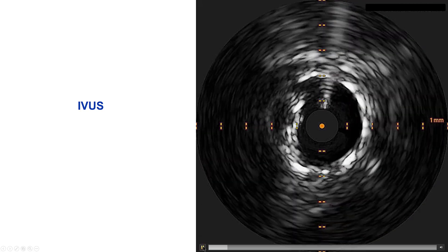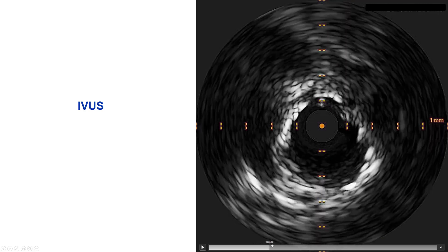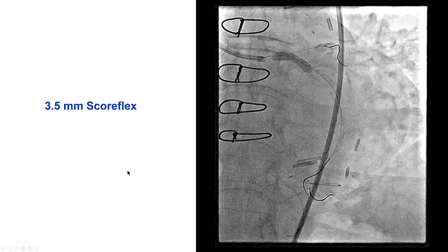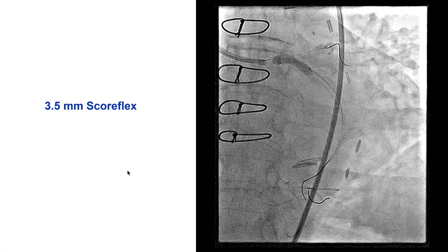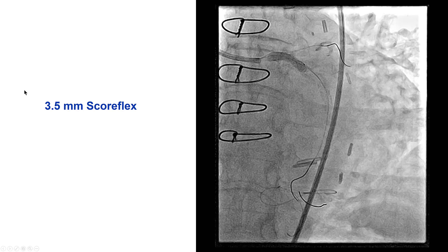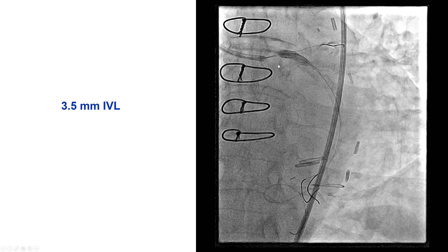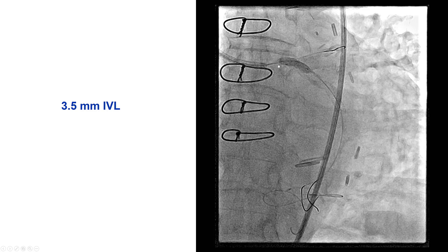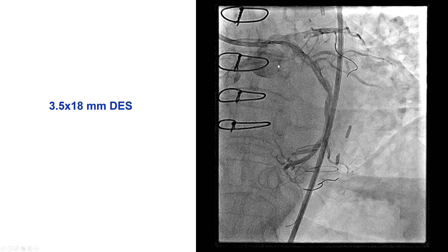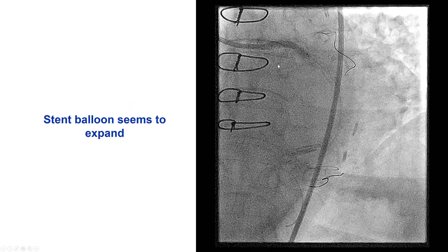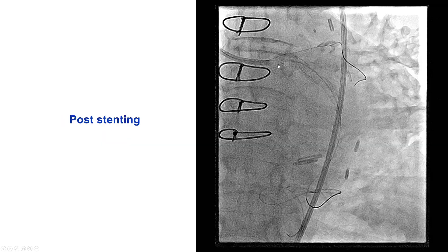We performed intravascular ultrasound to determine the situation, which showed significant calcification in an area of underexpansion — the IVUS catheter actually jumped in the middle of the lesion, making images difficult. We used a SCOREFLEX plaque modification balloon at 3.5 mm, which seemed to expand a little better but still had a slight waist. We then changed to intravascular lithotripsy with a 3.5 mm balloon at 4 atmospheres and delivered 80 pulses into the left main. That improved the stenosis, and we placed a 3.5 by 18 mm drug-eluting stent that seemed to expand well upon deployment.